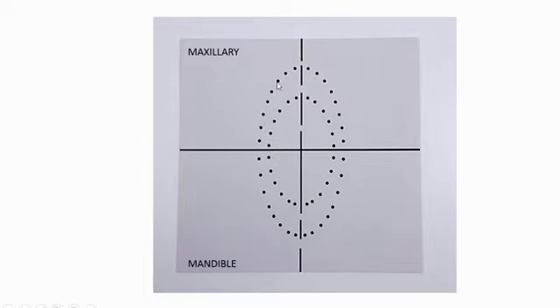Usually क्या होता है, when you get used to placing the rubber dams, you will be happy enough to place the rubber dam clamp on a distal tooth, which for example you want to start with 6. You will put a dam sheet on 7 and you will isolate 2 and more teeth. That will come with practice. Initially I'll say just start with a single tooth. So for example you're starting with a single tooth, just mark a dot with a pen or any marker by placing the rubber dam sheet over this template, and then you can punch.